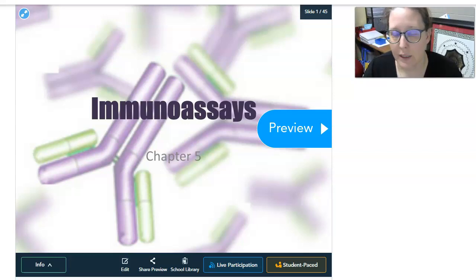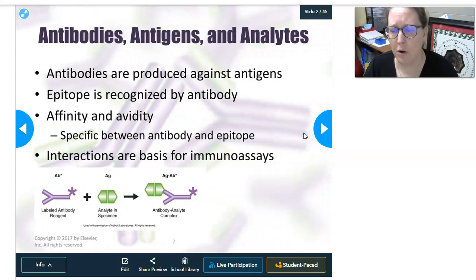So this is Dr. A, and we're gonna do a lesson on immunoassays. I know most of you probably have already had immunology. If you've not, you will have it soon. But it's worth for us to talk about immunoassays because they are widely used in clinical chemistry. And immunoassay modules are a part of a lot of the bigger analyzers that are used in clinical chemistry.